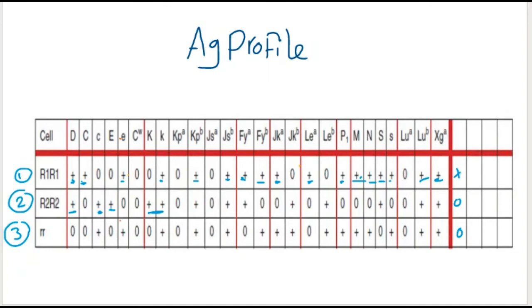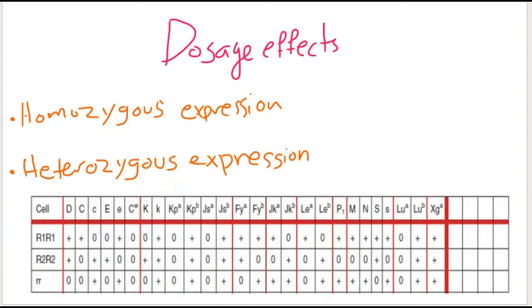Before that, we want to understand what the dosage effect is. We just said that in red blood cell reagent, the clinically significant antigens should be expressed on the screening cells homozygotally between them. So, for example, here in cell number 1, let's see the antithetical antigens. Antithetical antigens means one of them at least must be present, or it's not a must, but usually one of them is present.